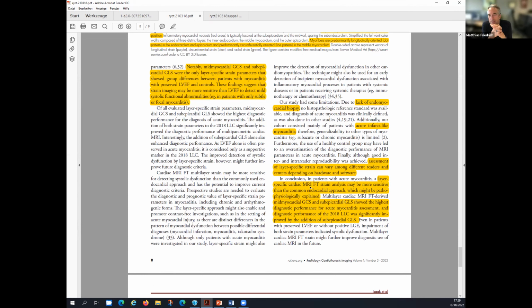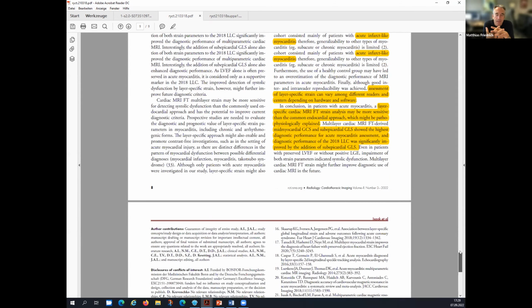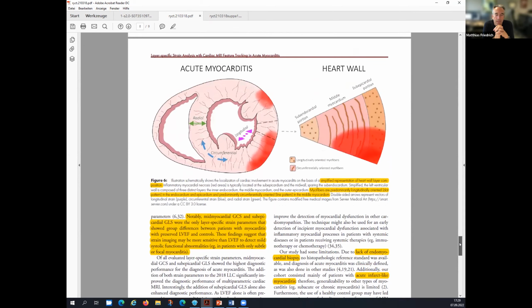Thank you very much for a great presentation of this fantastic work, Julian. You have already done a lot for the field of myocarditis, and this may be a strong indicator that strain may eventually put the function, as you indicated, into a conventional criterion for the Lake Louise criteria, because it has a discriminative power, especially as you pointed out, because it's so different from ischemic lesions, where the problem is more in the longitudinal subendocardial fibers.